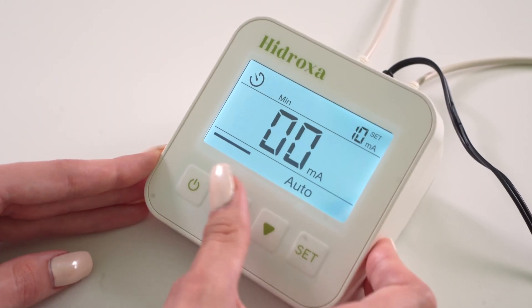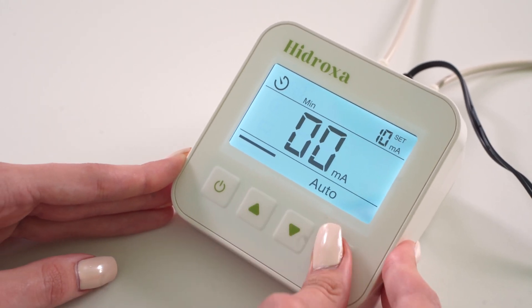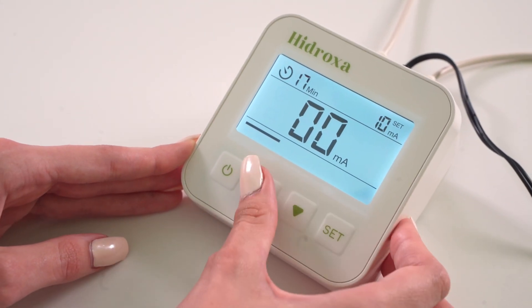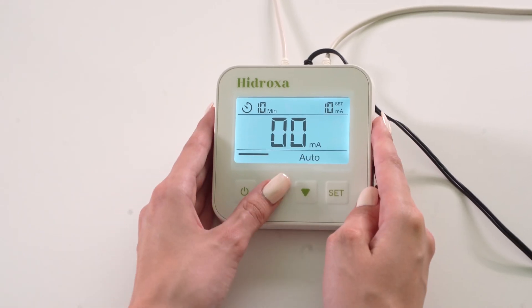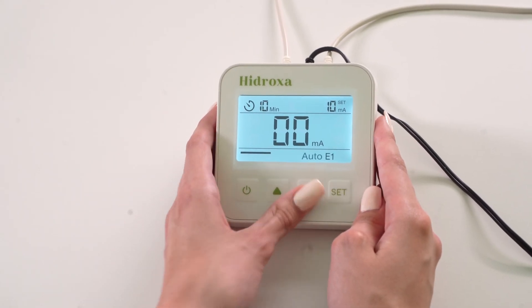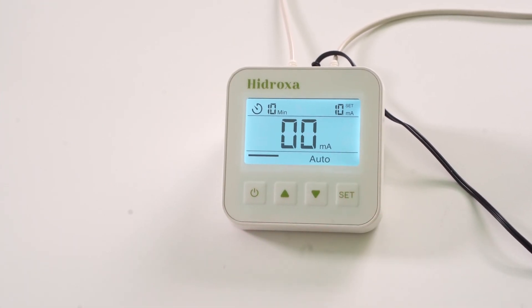The built-in timer can be set from 1 to 40 minutes. Polarity can switch automatically for balanced treatment or be fixed manually for targeted use. Use the arrow buttons to adjust settings. You'll see symbols for current type, time, and polarity on the screen.